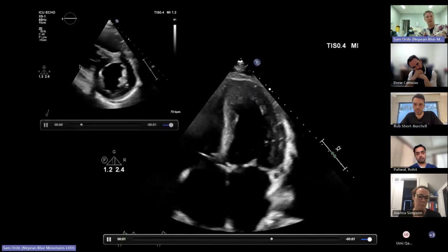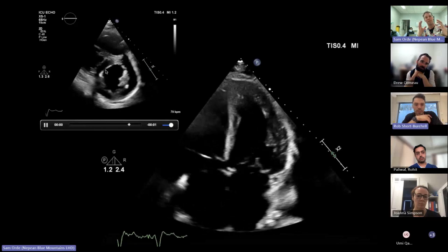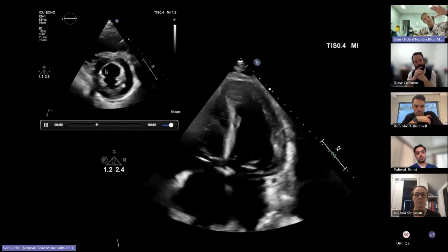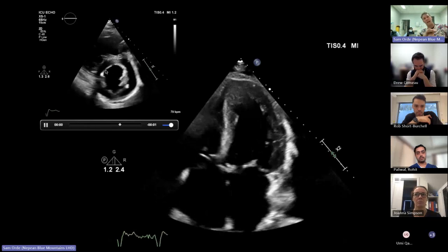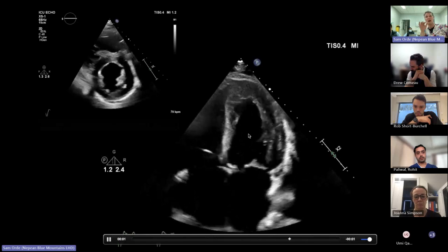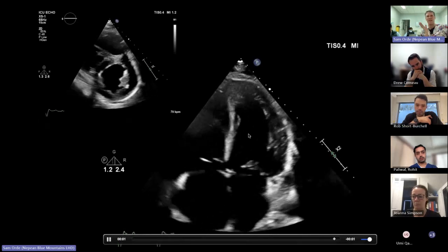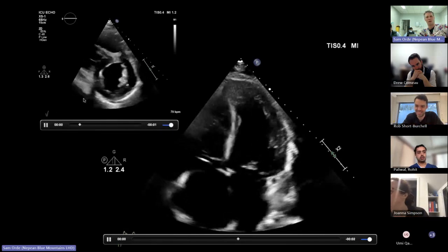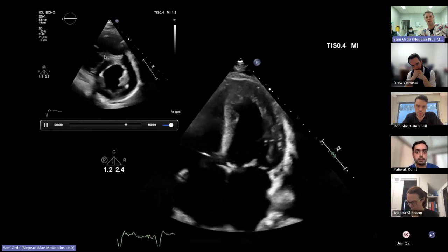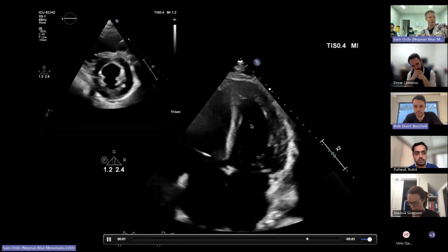Yeah. So remember, the reason why I love the short axis one is because often it's harder to mess up, but also because you've got some of those regional walls, or most of the segments, in the axial plane rather than the lateral plane. And if we're looking for thickening on the lateral plane for the apical 4, you sometimes miss that movement of the endocardium. So I don't have any evidence to back this up, but I feel I've got a lot more confidence looking at that short axis view for the regional wall motion abnormalities versus the apical views, but minor stuff.